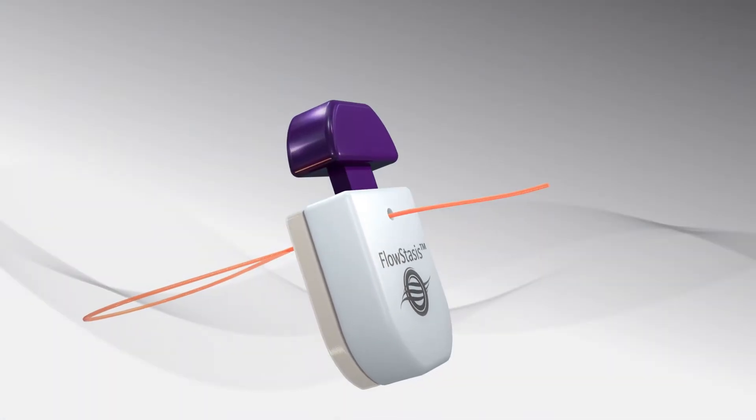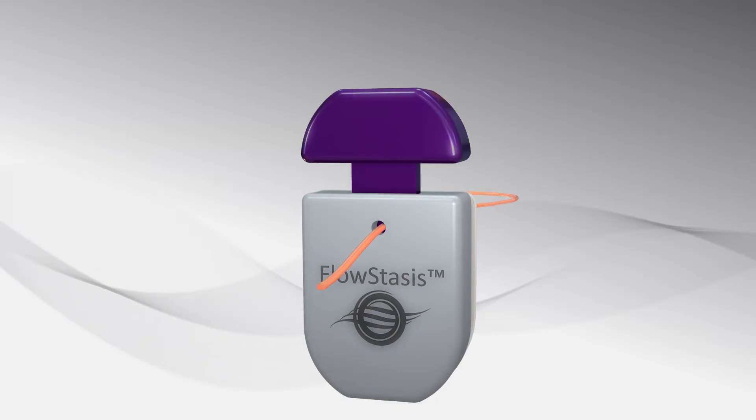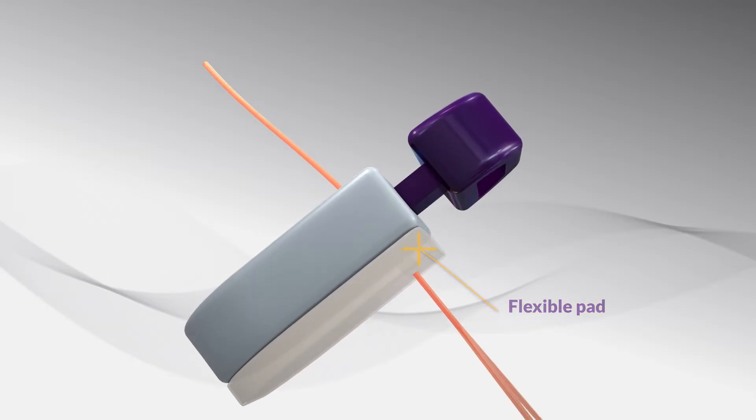The Flowstasis features a preloaded threader that pulls the suture through the device, an actuating tab that holds or releases suture tension, and a flexible pad that conforms to patient anatomy.